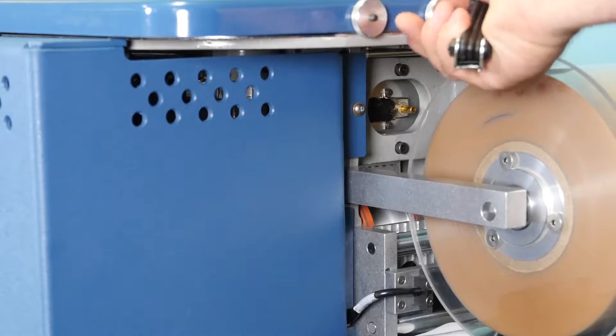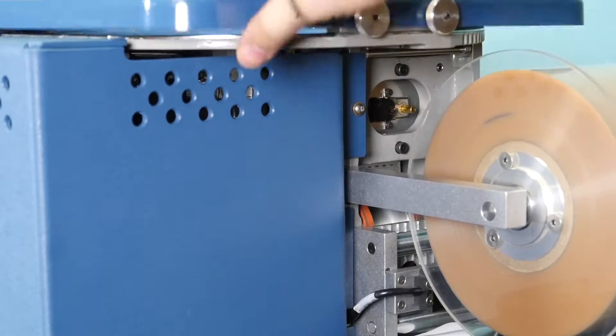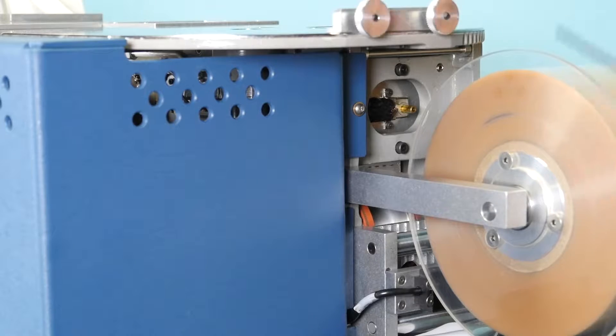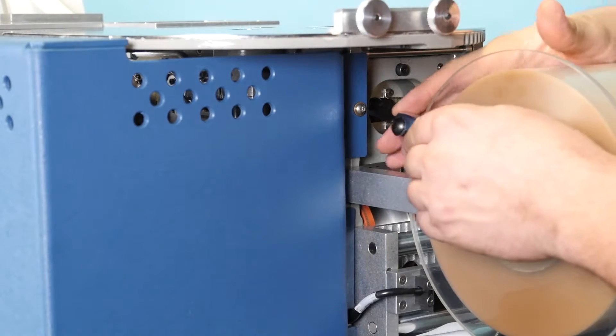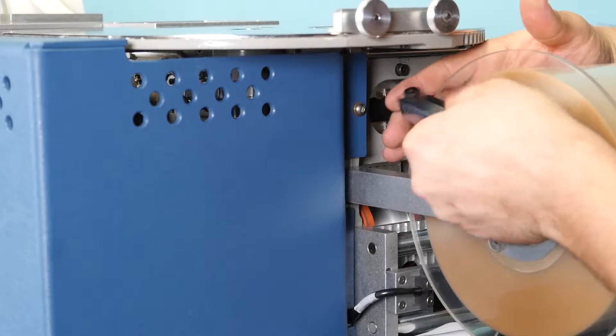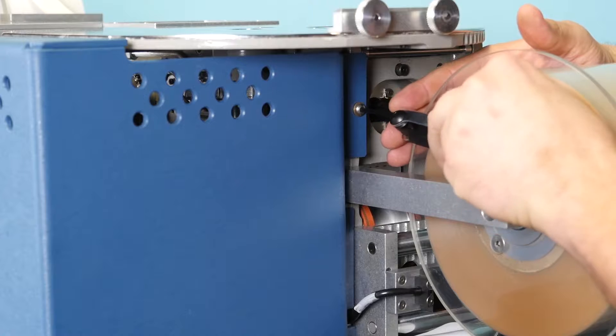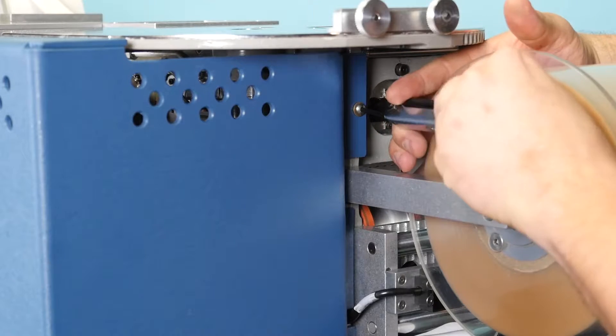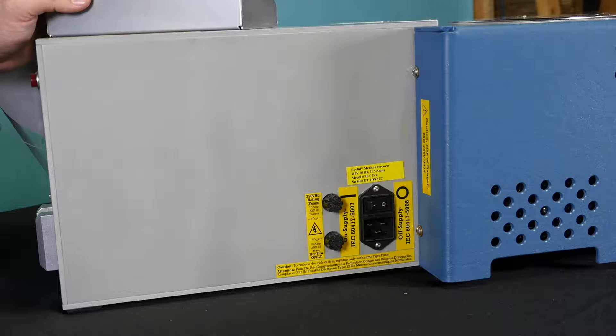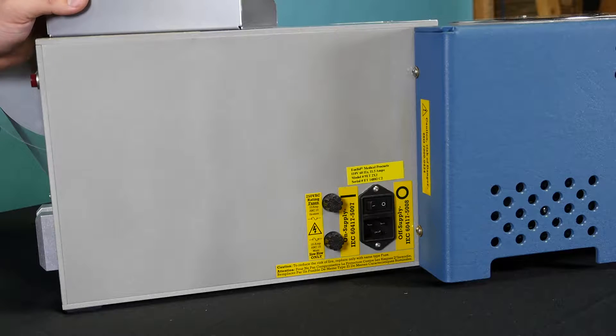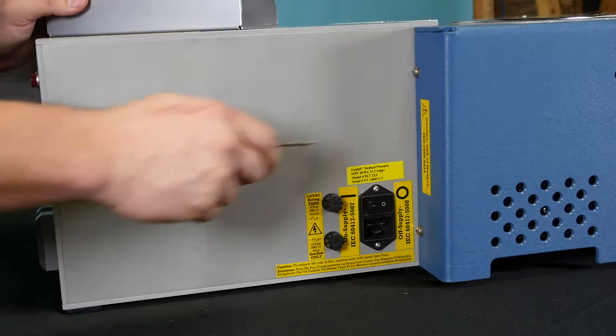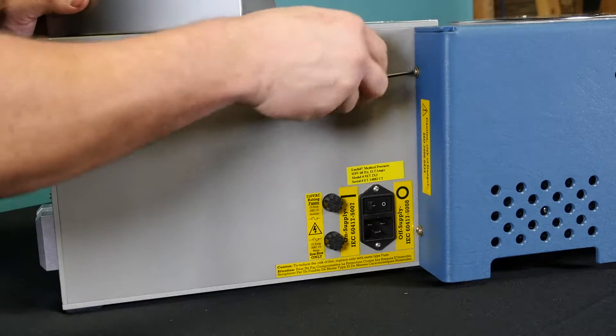First, you want to make sure the machine is off and unplugged. Then remove the button head screw underneath the tabletop. Then loosen two button head screws on back of the machine.